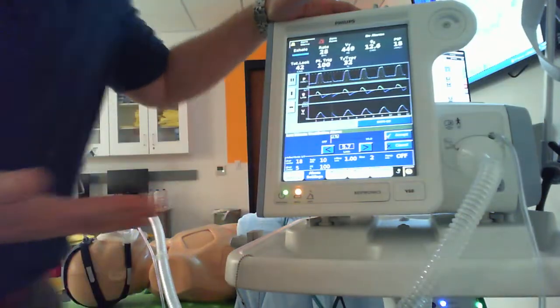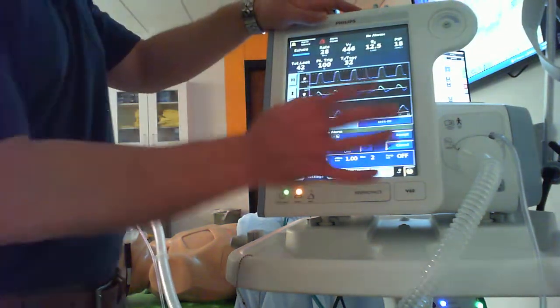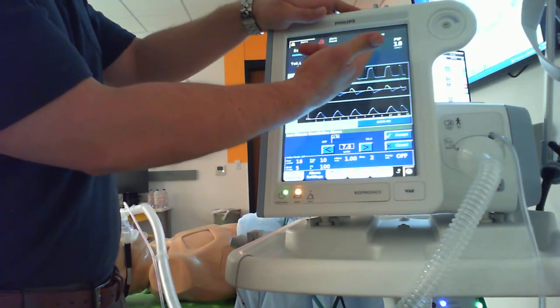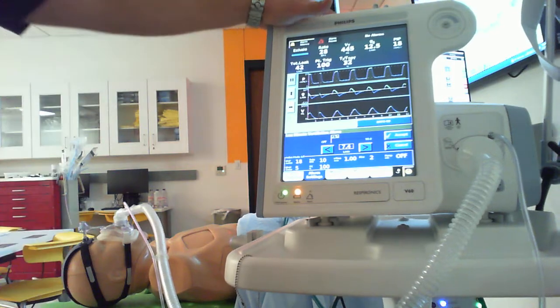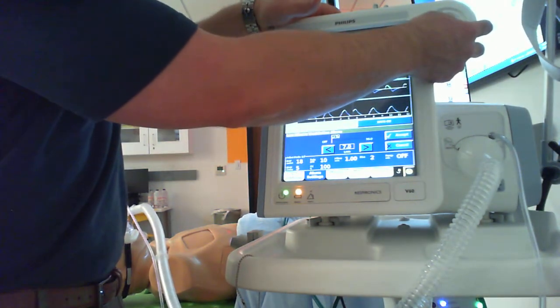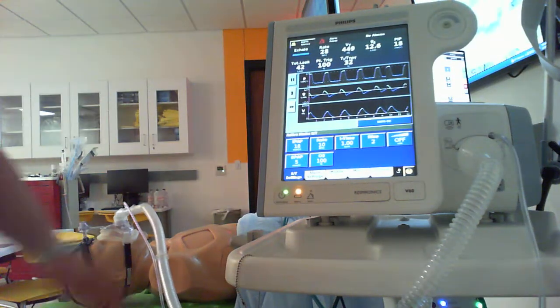Okay, I don't want to come into the room and their minute ventilation is 3 liters a minute and they're dead or something like that. Hopefully all my other alarms are set appropriately. Some people have set that 50% beneath your current minute ventilation. It's really a comfort level. I'm going to set this kind of at that patient's 100 mil per kilo, which would make more sense as we get into invasive ventilation. All right, I would go ahead.